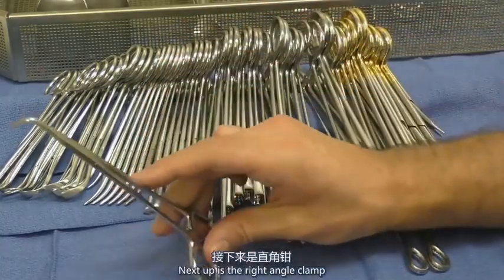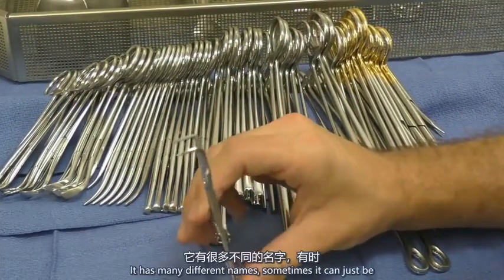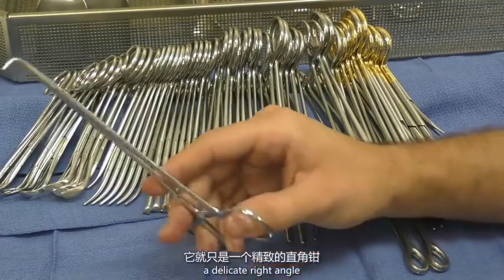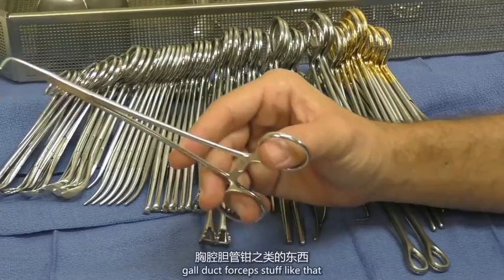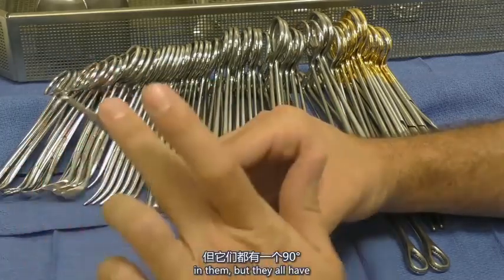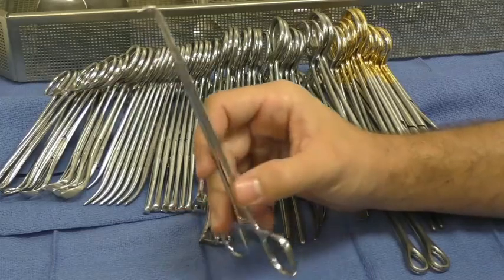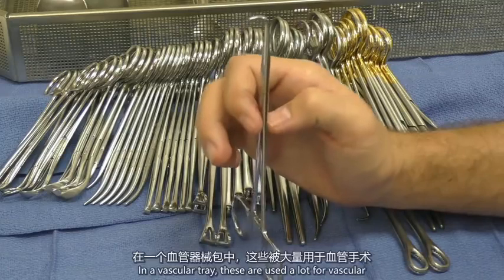Next up is the right angle clamp. Surgeons will just call it a right angle. It has many different names. Sometimes it can just be a delicate right angle. Sometimes it'll be called a thoracic gall duct forceps, stuff like that. Basically, those just have different types of serrations in them, but they all have the right angle physical property to it. In a vascular tray, these are used a lot for vascular.